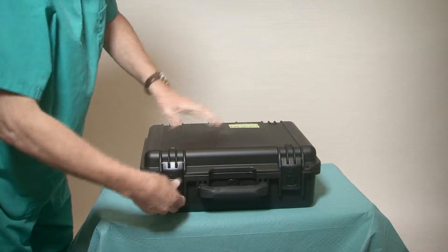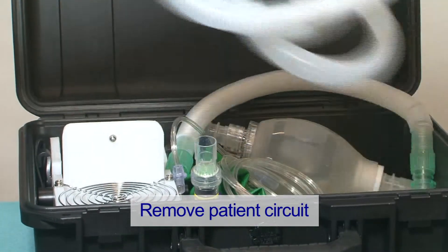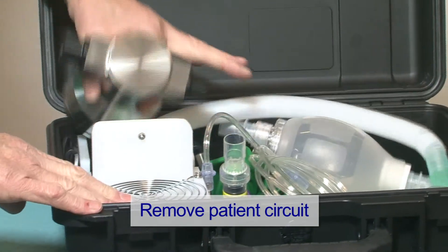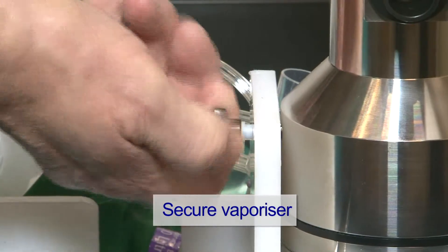Open the case and remove the patient circuit. Undo the retaining strap from the vaporizer and secure it to the support stand with the screw behind the support stand.